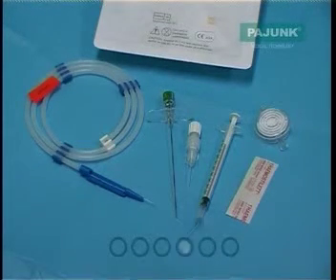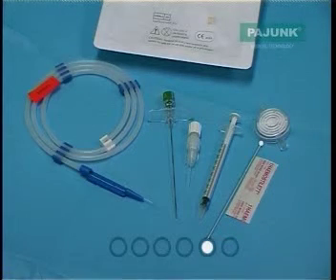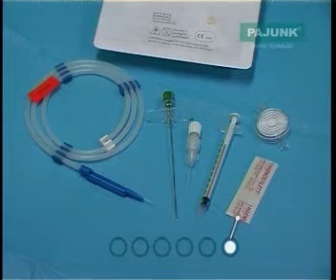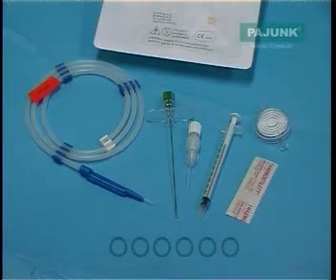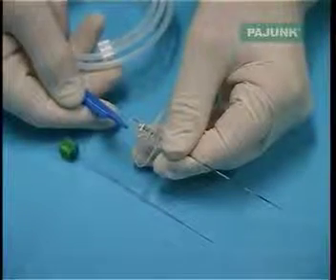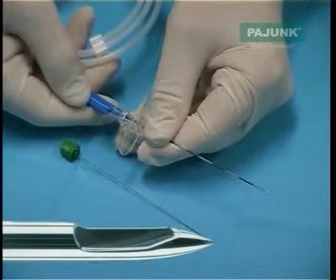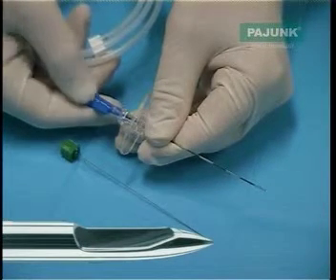Next is a 1ml syringe. To the right of this is a 0.2 micron filter, and below this is a stilette, which we use to incise the skin to aid the passage of the Sprotte needle. The Sprotte needle has the familiar atraumatic tip, but it has been modified to allow passage of the 25-gauge catheter in that there is a small ramp in the tip that allows the catheter to pass through the eye.